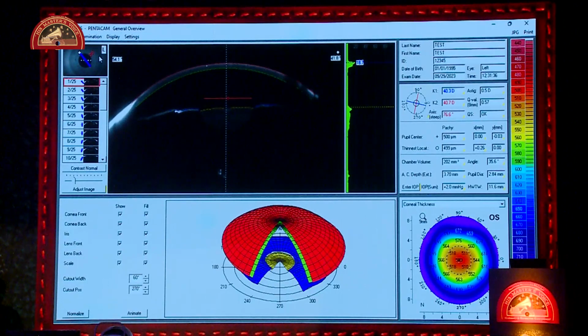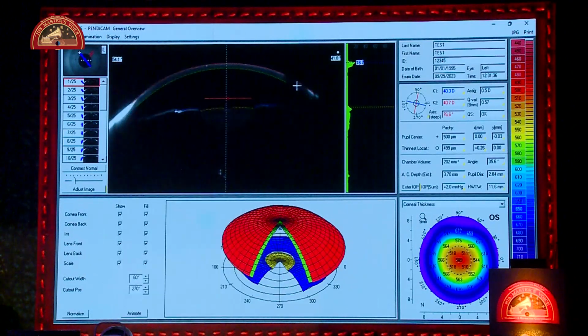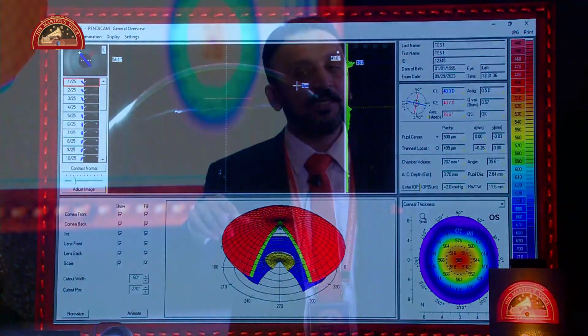One interesting thing we should follow is to tell the patient what to expect inside. If the patient sits there and does not know where exactly to focus, it can lead to confusion and they may start chasing the light. So always tell them that there is a blue streak of light which rotates. In the center of the blue light there is a red light, and in the center of that there is a fixation point. That's where you're going to look.